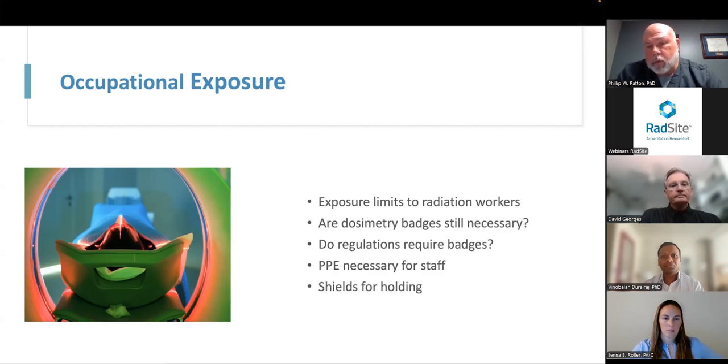But the real beauty of that is you can see if that number starts climbing. If there's a change in the environment, where you said, hey, they don't get 10%, but this dosimeter is now receiving 1.5 times what it used to, do we need to reinvestigate if the workers need to have dosimeters? So yeah, an area badge, especially for the cost and the ease of use, it's a no-brainer, basically.